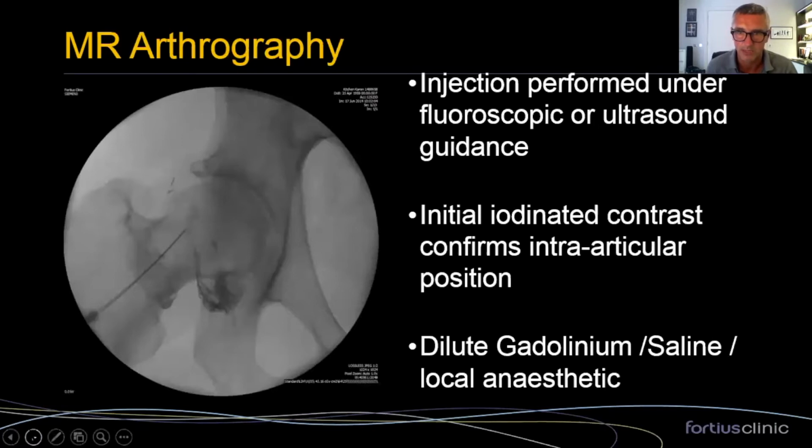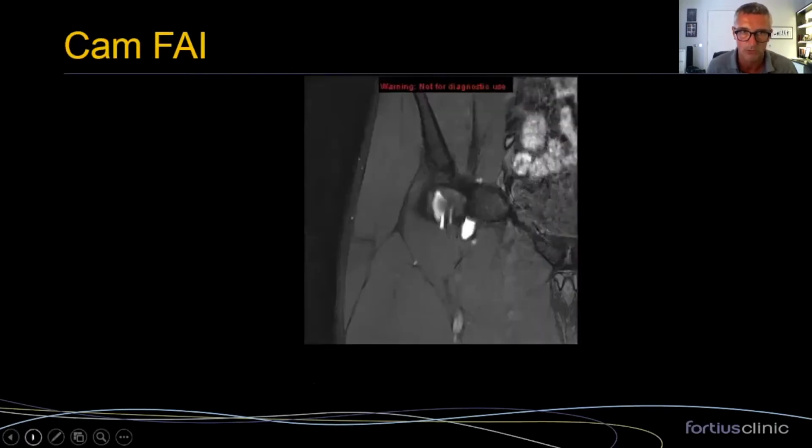So saying that, we obviously still do perform quite a high number of them, and this would be a typical picture. There are various access techniques. I know a lot of you will be doing your own arthrograms anyway. Just out of interest, this patient has an arthritis already, of course, but if you have a fairly benign looking hip, if you go into the superior femoral head-neck junction, that technically is the highest accuracy rate for less leak of contrast and less painful, again, according to radiological imaging.